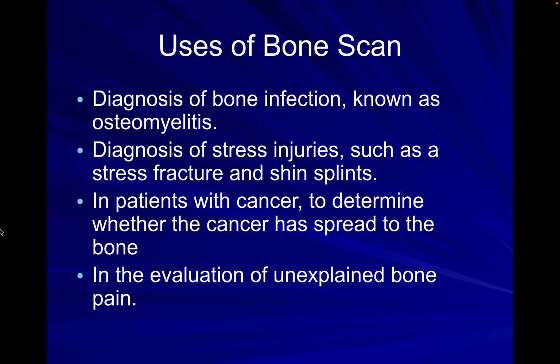It's often used in evaluation of osteomyelitis, which is an infection of the bone, often used in evaluation of stress injuries like a stress fracture, and sometimes in folks who are being evaluated for cancer when there's concern for metastatic spread to the bone, and sometimes if people are having continued bony related pain and you have done other advanced imaging and it's been unremarkable, you might use a bone scan as another alternative modality.